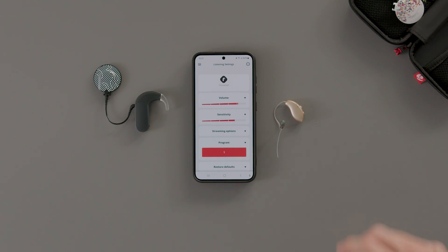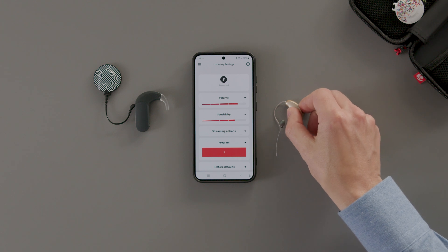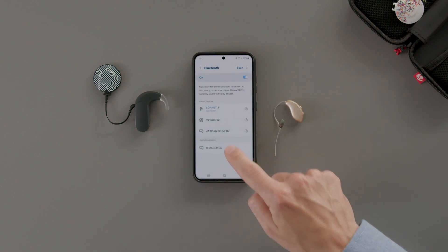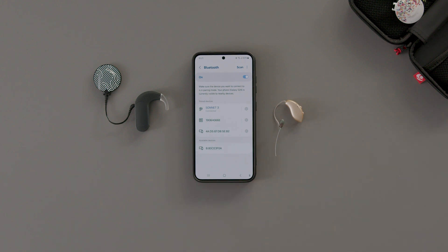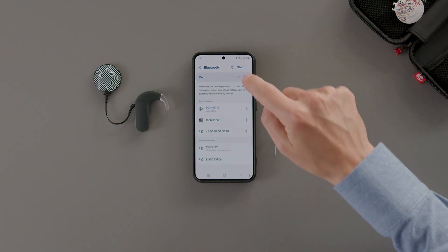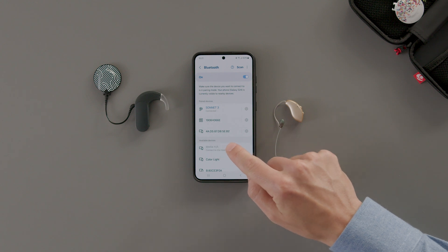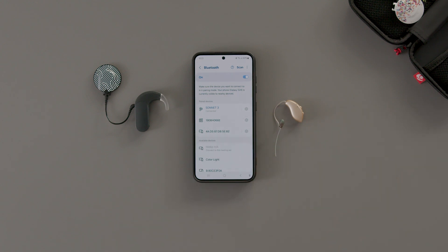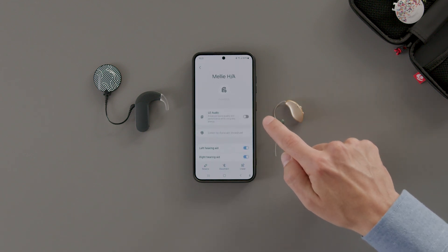Once Sonnet 3 is connected, turn on your hearing aid, then pair your hearing aid using your phone's Bluetooth settings. If your hearing aid supports Bluetooth LE audio, make sure this setting is disabled in the Bluetooth menu.